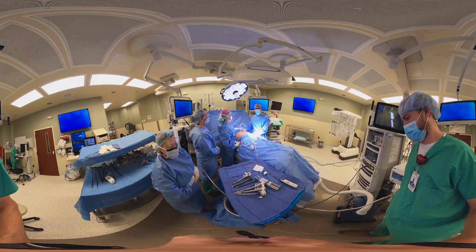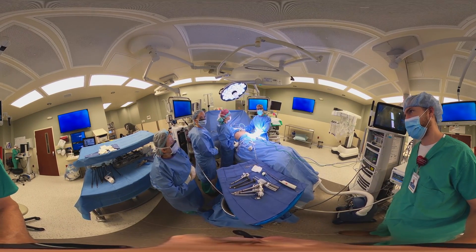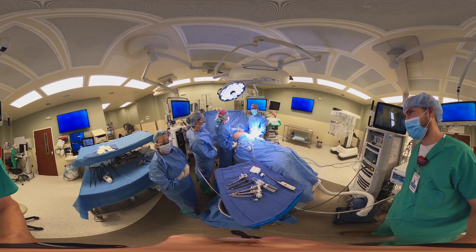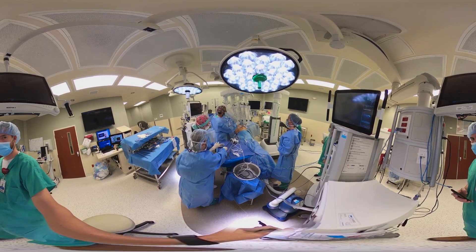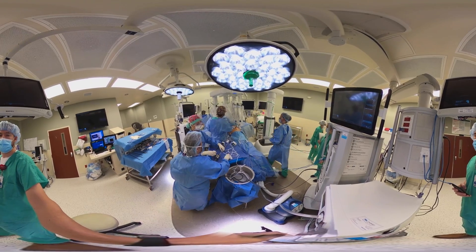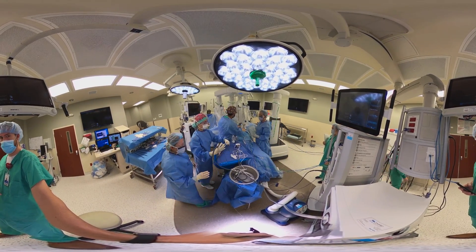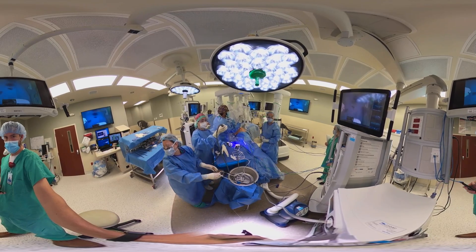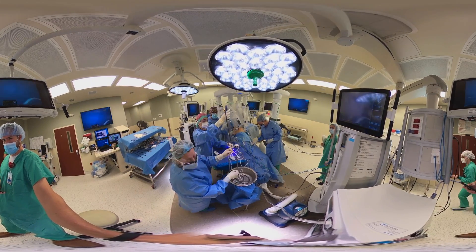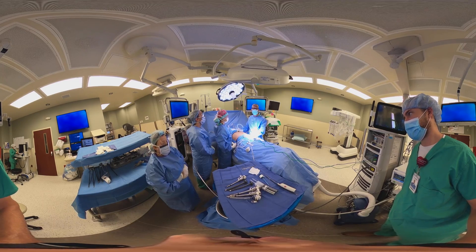Good morning, my name is Dr. Mark Araujo and today we'll be proposing a robot-assisted sleeve gastrectomy. This is going to allow patients to move away from open surgery and allow for a quick recovery. We hope to continue the operation through a series of small incisions that are going to allow the patient to recover with minimal pain and return home quickly.